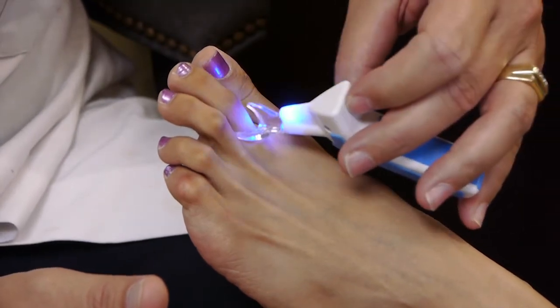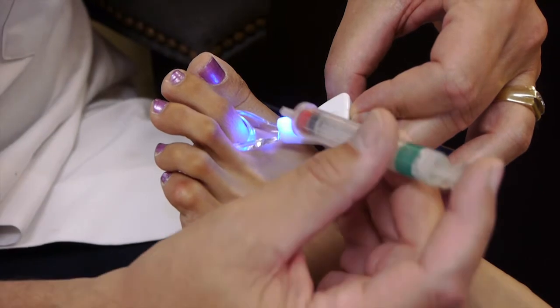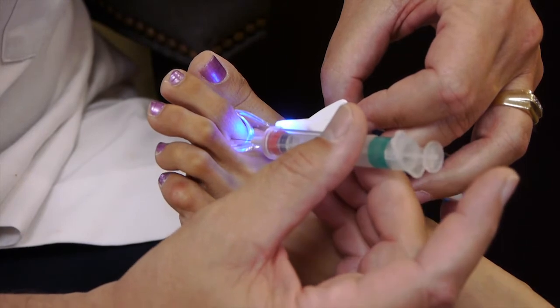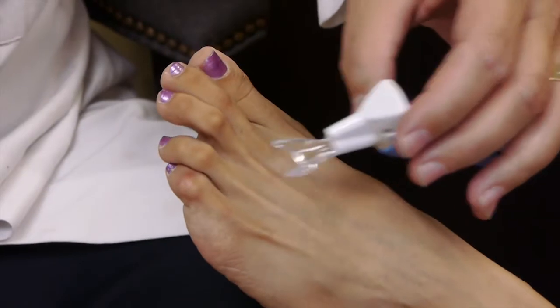So in this case, what I would do for a digital block of the second digit, I put the device directly on the top of the toe like this, and once again I give 2 injections, one on the dorsal medial aspect, just like this, and the second is on the dorsal lateral aspect, just like this. I've never had to use it on the bottom of the toe, but I guess that I could.